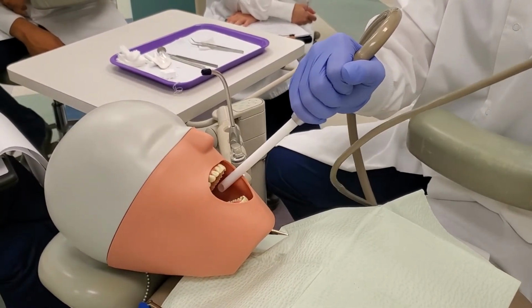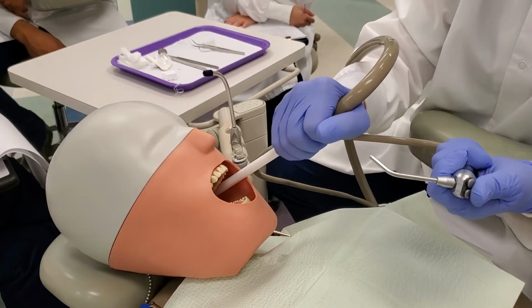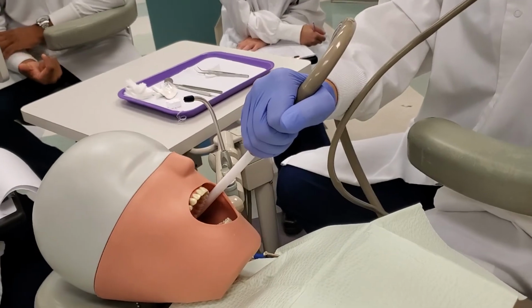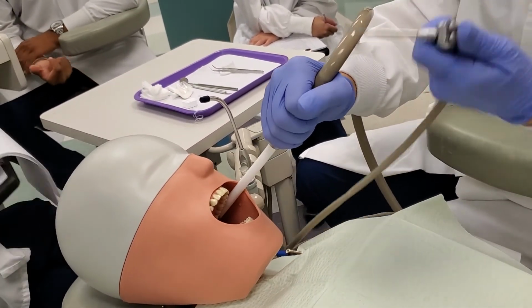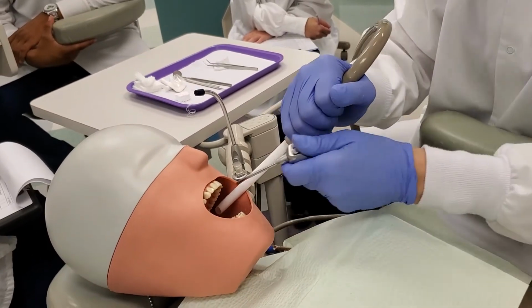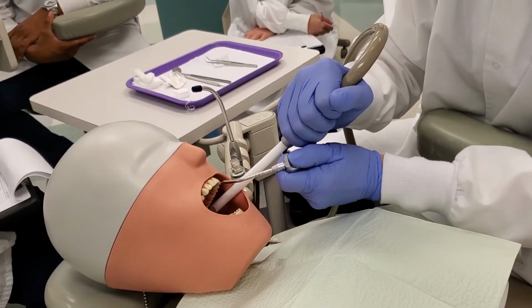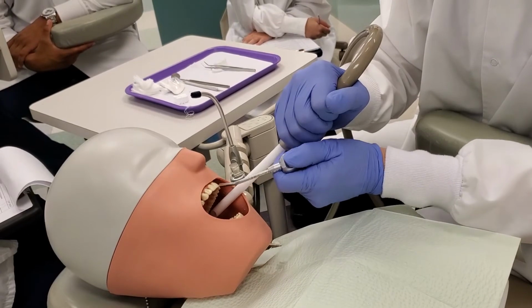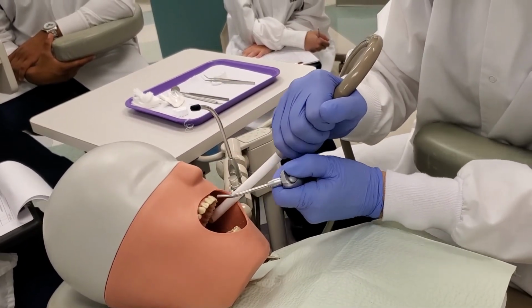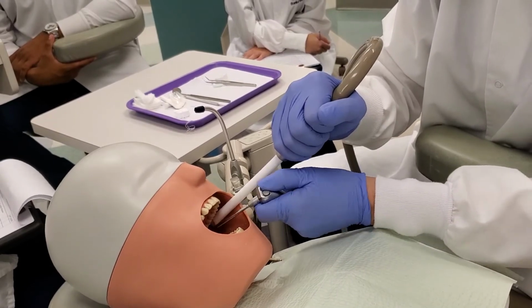You're only moving this, okay? This guy here has to stay here so that he can collect all that water that's coming straight back to the throat. Does that make sense? So don't worry about moving him so much, but move this one. So you're just going to do the air water syringe. You come all the way back and come back, getting back in that throat, and then you dry it off. And then just come back and dry everything off.